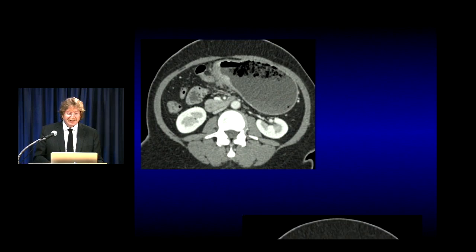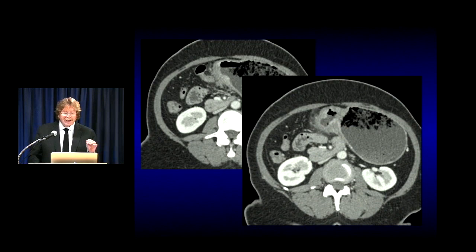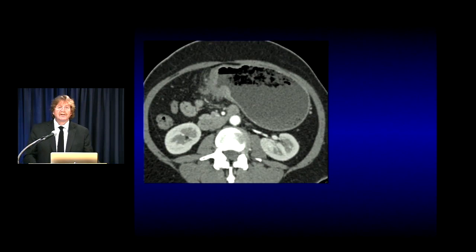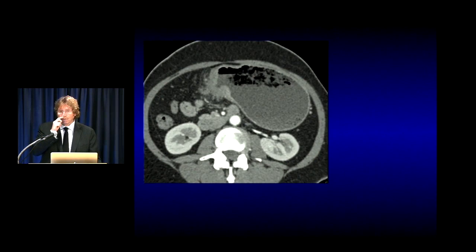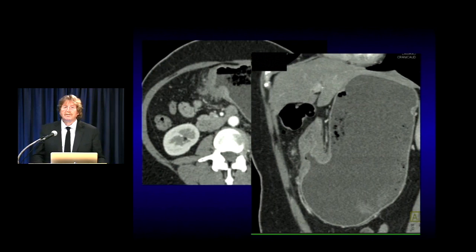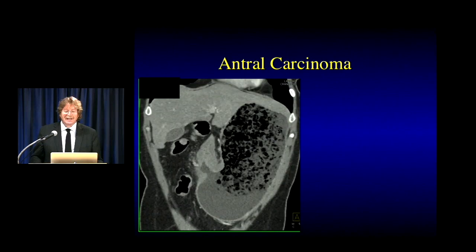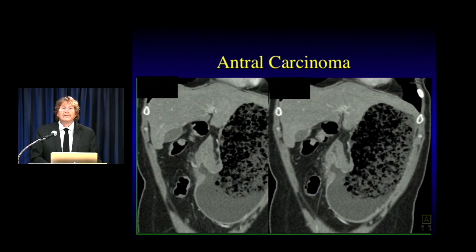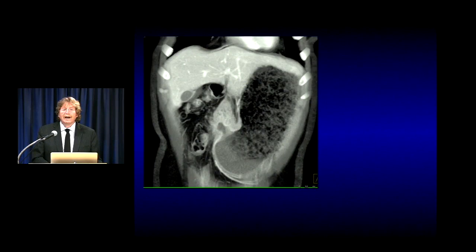The flip side is this case where you see thickening of the antrum and there's no mistake: there's abnormal enhancement, irregularity, ulceration — there's a tumor. This case also tells you another important thing: there's food in the stomach. When you see lots of food in the stomach, I'm always concerned — maybe the patient has delayed gastric emptying or a gastric outlet obstruction. Sure enough, there's diffuse thickening in the antrum with stranding. In coronal display, you see the infiltration; it's more than 12 millimeters, asymmetric, irregular — classic antral carcinoma.